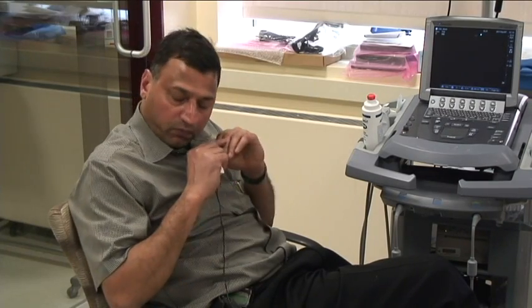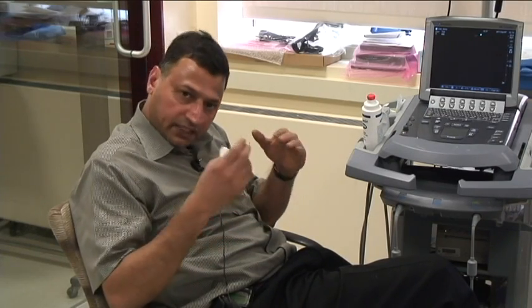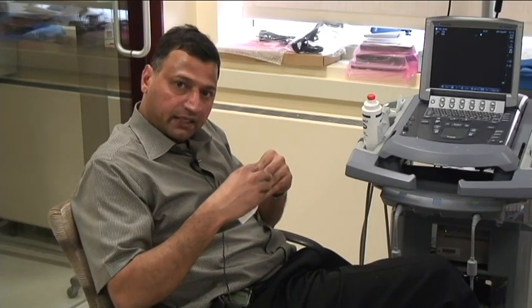It's useful to remember the dynamics of cardiac filling changes when you're breathing spontaneously versus mechanical ventilation, which is across the board positive pressure ventilation. Whereas in a spontaneously breathing patient, your IVC caliber is going to decrease with inspiration and increase with expiration, it is the reverse in a mechanically ventilated patient. Because of the positive pressure, the caliber of the IVC is going to increase with inspiration, and it's going to decrease with expiration. But regardless of that fact, we are assuming that the changes will reflect intravascular status, and it's the maximum versus the minimum diameter that we're going to use when we calculate the index.